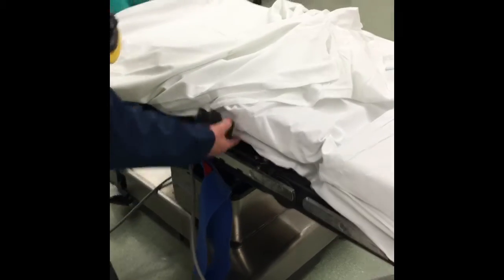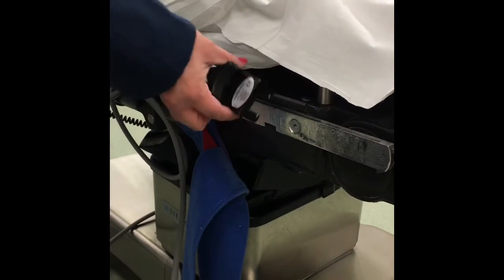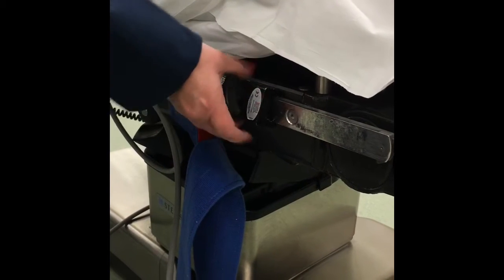And this is gonna hook into this section of the bed. So always put it on first, and it has these grooves right here that match up. So you go from the top until it easily goes down and you can slide it.